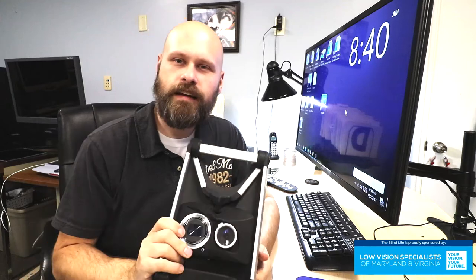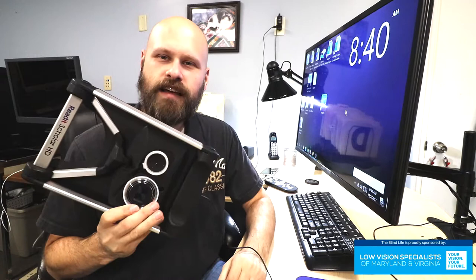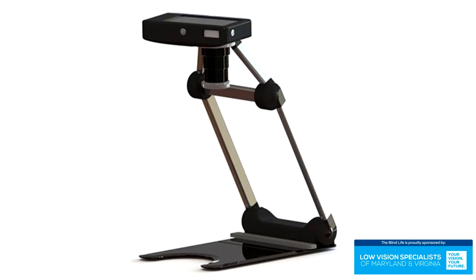Today we're taking a look at the Read It Scholar HD. Hey guys, it's Sam with The Blind Life. So this is the Read It Scholar HD. It's a portable digital magnifier, a desktop magnifier, a CCTV.